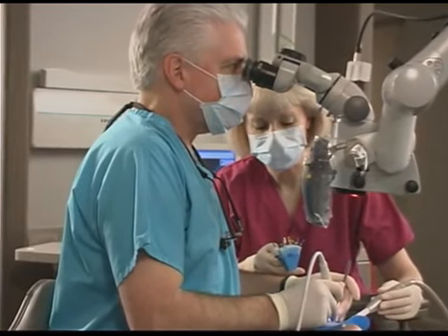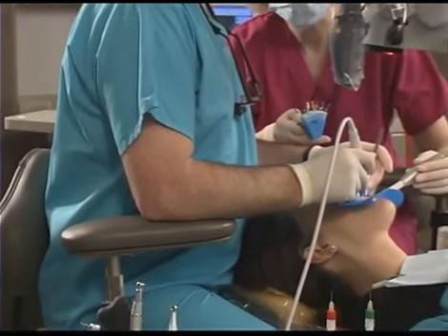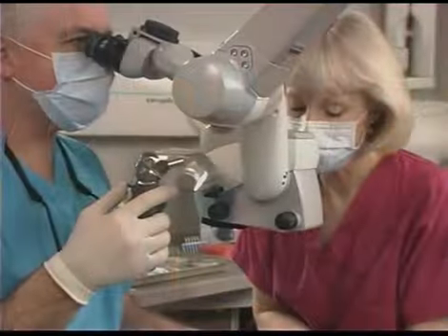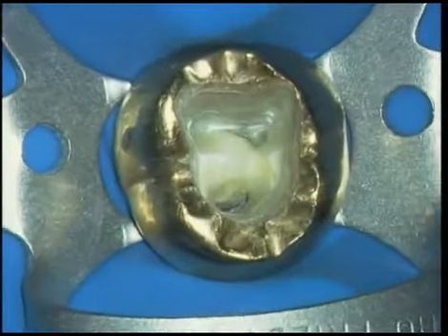Doctor stools are important with the armrest feature because it allows us to have shoulder support and lumbar support so we can be comfortable during our procedures. The pistol grip handles allow us to adjust the light intensity, focus, and the zoom feature.